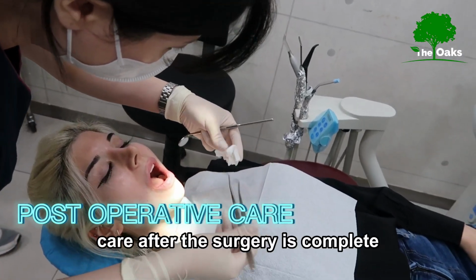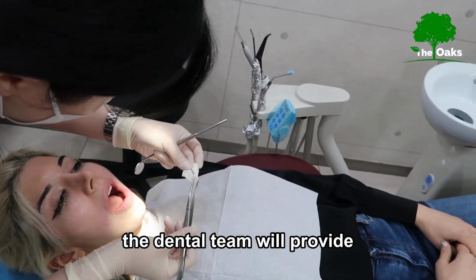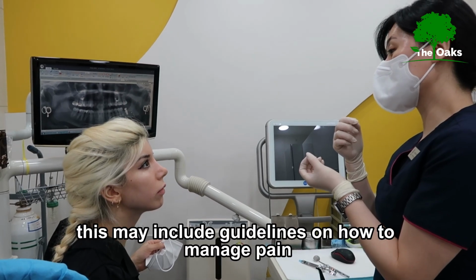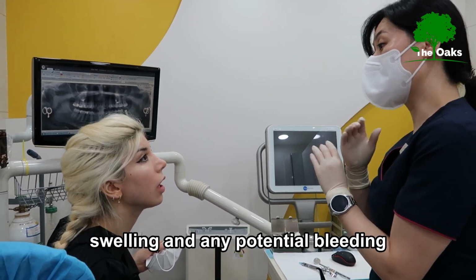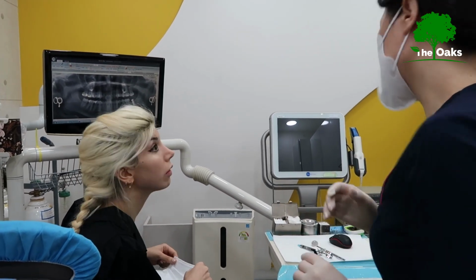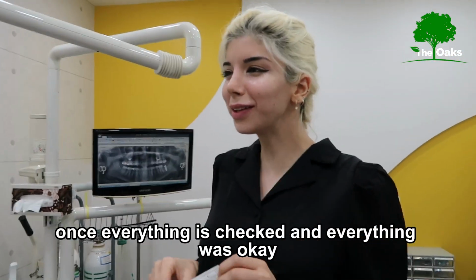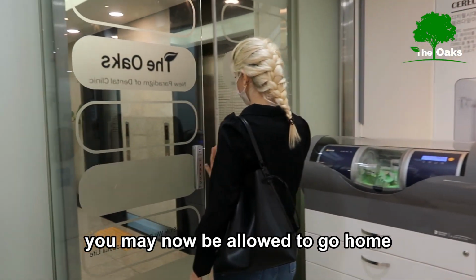Post-operative care. After the surgery is complete, the dental team will provide you with post-operative instructions to follow at home. This may include guidelines on how to manage pain, swelling, and any potential bleeding. Once everything is checked and everything is okay, you may now be allowed to go home.